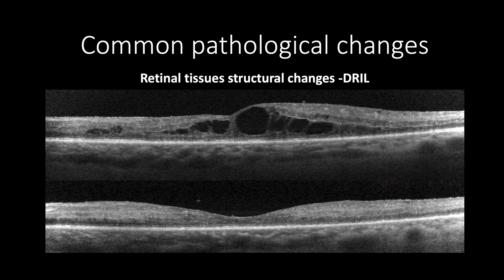Therefore, when a patient has long-term inner retinal tissue structure changes such as cystoid macular edema, the patient will suffer some degree of visual impairment due to the disorganization of the inner retinal layers. This is an example of central diabetic macular edema presented with intra-retinal cysts disrupting the boundaries between the inner retinal layers.